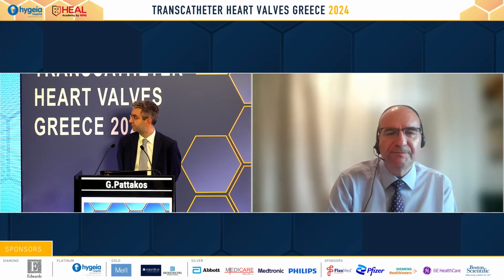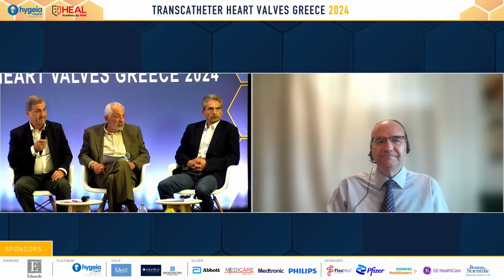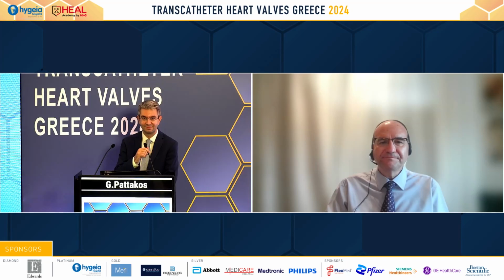Yeah. I agree with you. Thanks a lot. Thank you very much. If you ever take a Percival out, they are really hard to get out. I've only removed the Percival when it's fresh, only a few days in. When it's been in there for a long time, once they heal, they're horrible.